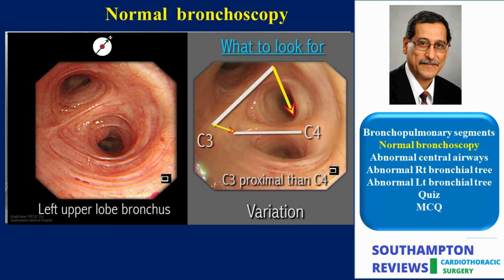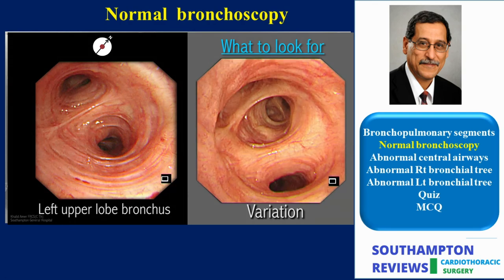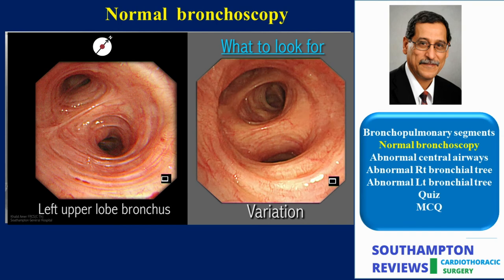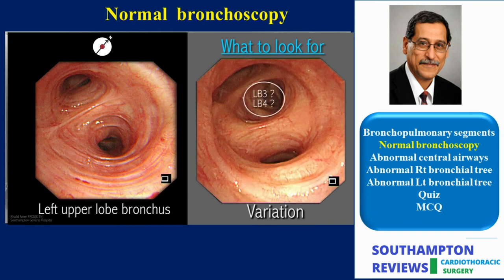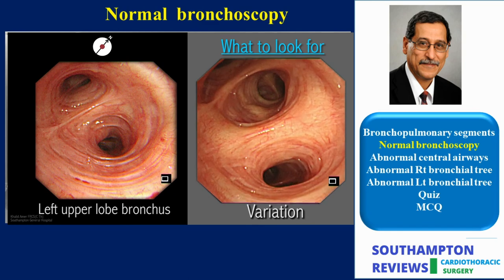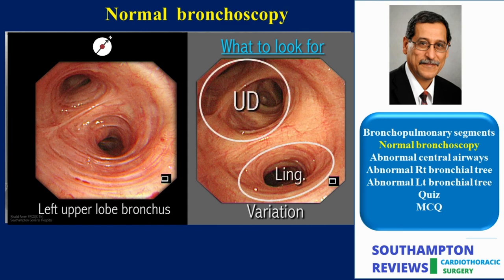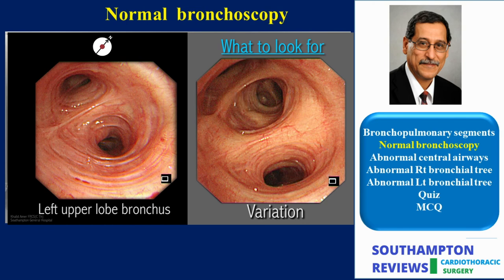This is another example highlighting the same problem. The left upper lobe has three divisions and the middle one is a dilemma — it could be Lb4, superior segment of the lingula, or Lb3, the anterior segment of the upper division. The deciding factor will be proper identification of the carinae. It will be noted here that this is the higher or more proximal tertiary carina C3, compared to the lower or more distant quaternary carina C4. This clearly divides the lingula from the upper division, and the middle orifice certainly in this example belongs to the upper division — therefore it has to be Lb3. Again, this is made clearer when zooming in to enlarge the origin of the carinae.